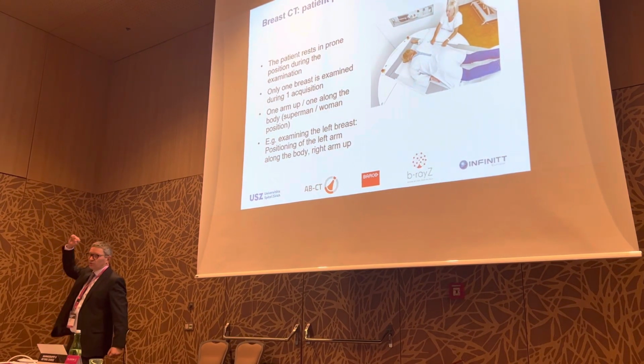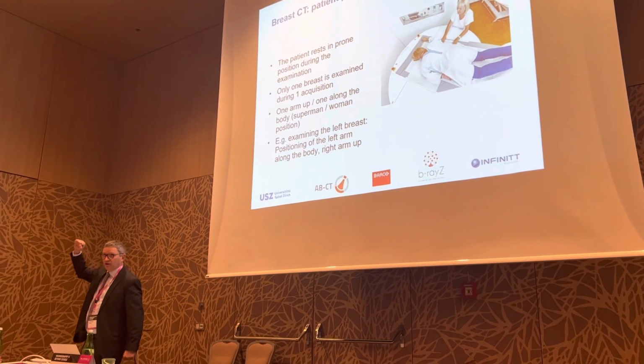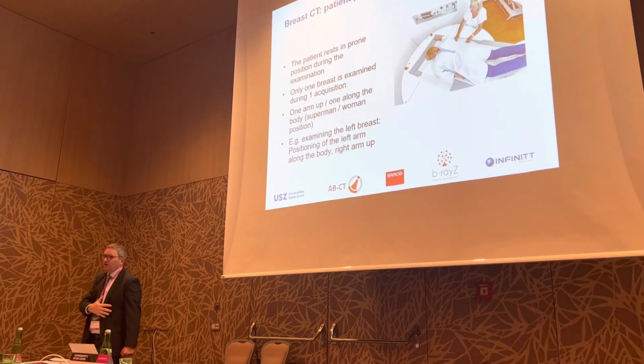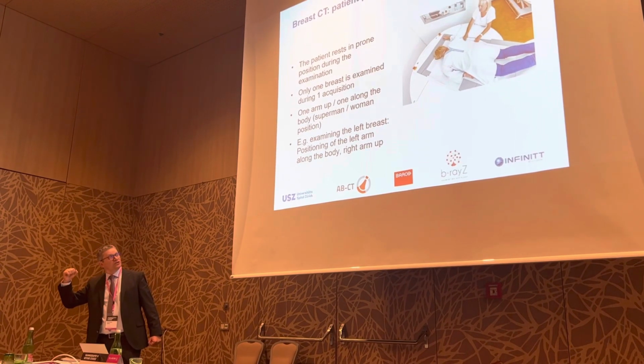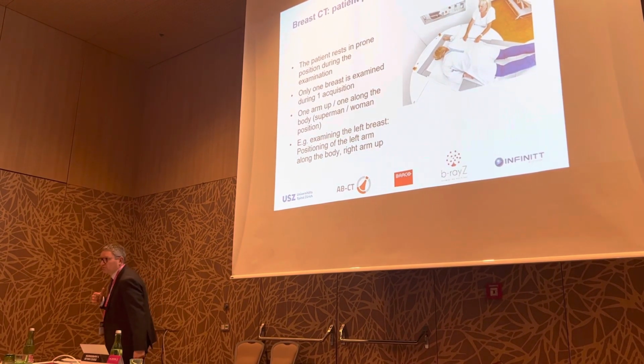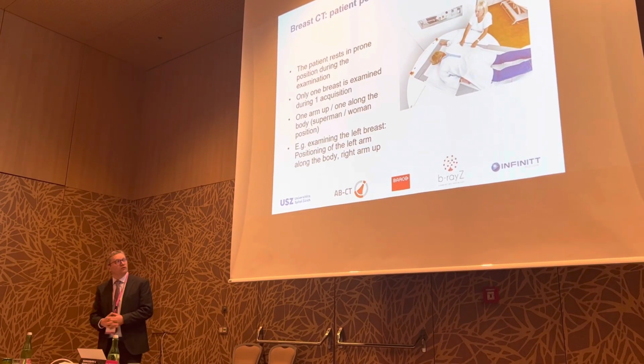We call it the superwoman position: one arm up, the other arm down, and the arm which is down is the side which you are imaging. So the idea behind that position is that you get as close as possible to the patient table, so that you can cover as much as possible of the breast.